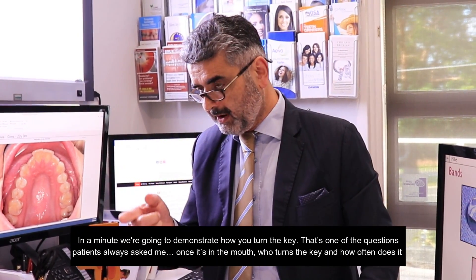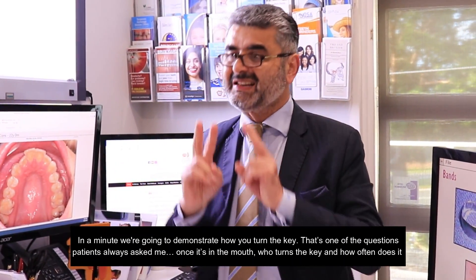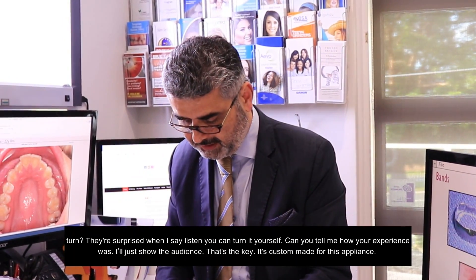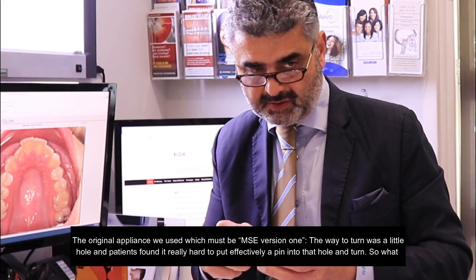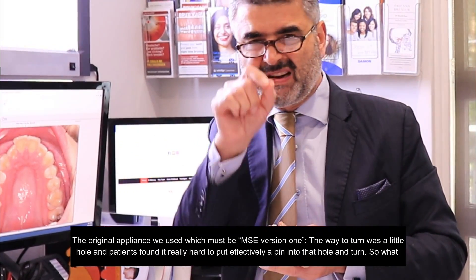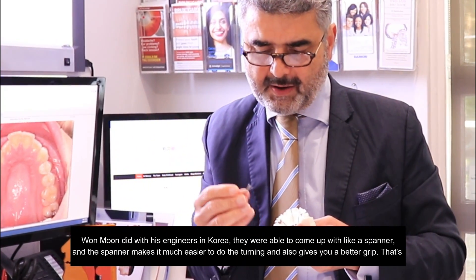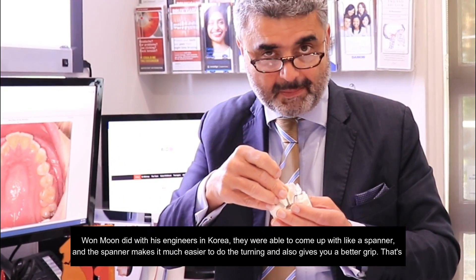In a minute we're going to demonstrate how you turn the key. One of the questions patients always ask is: once that's in the mouth, who turns the key and how often? They're surprised when I say you can turn it yourself. So that's the key — it's custom made for this appliance. The original MSE version one had a little hole, and patients had a really hard time inserting effectively a pin into that hole and turning it. So what Won Moon did with his engineers in Korea, they came up with a spanner, which makes it much easier to do the turning and gives you a better grip.